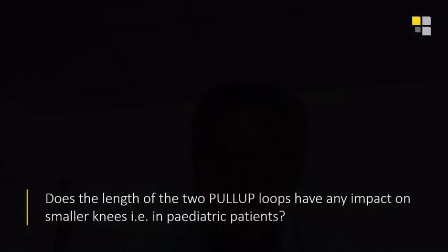No. It's a very important question. The system is based on the Japanese finger trap, and don't do any knot, because if you do, you don't let the good tension on the finger trap, which is the capacity of grabbing the thread. So never do any knot. It's not a good option, and it's counterproductive. Don't do this.